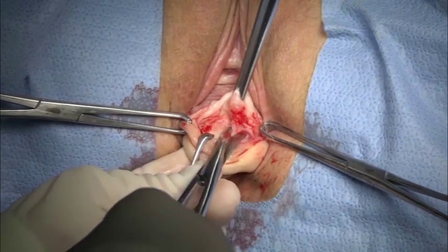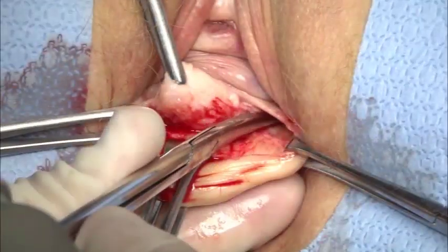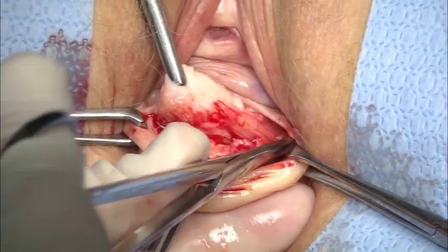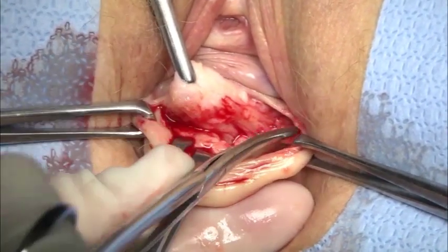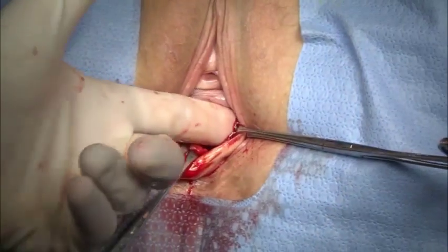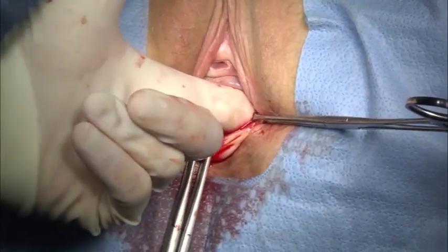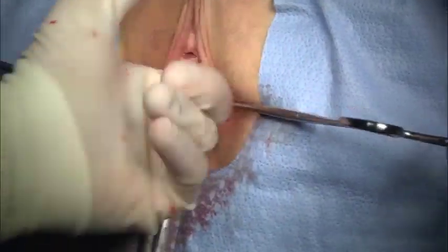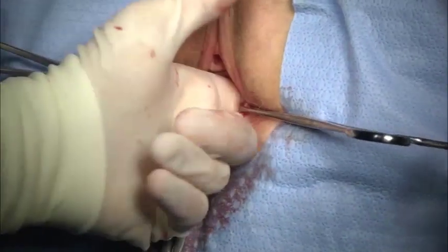Further dissection is carried out laterally. I accomplish this by gentle spreading with the Metzenbaum scissors, followed by finger dissection along the obturator muscle on the patient's left. I sweep my finger, maintaining firm lateral sidewall pressure against the obturator internus muscle in a downward and medial motion, cleaning off the sidewall and creating a smooth tunnel toward the ischial spine on the patient's left side.